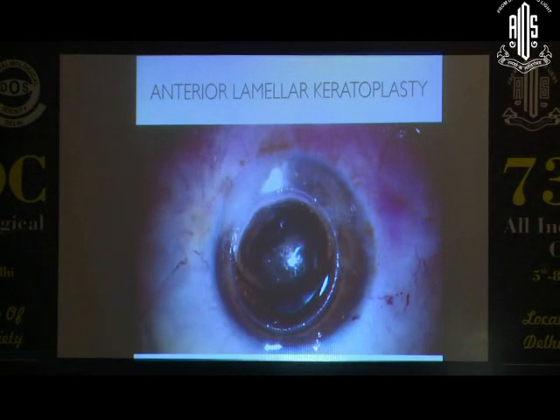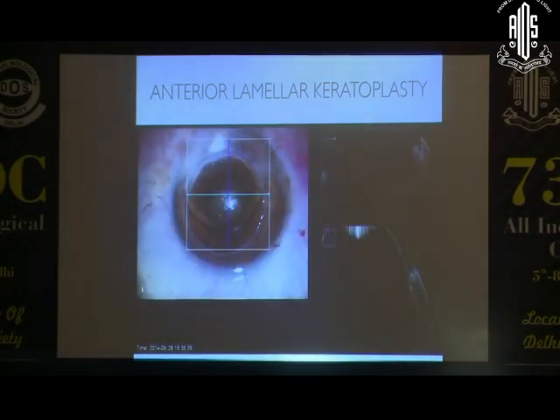And already it is looking very clear. So now you're ready to put your graft back in place, but what do you do with the bubble? So we decided that instead of leaving the bubble in place, you can see the dimensions of the bubble actually look quite big. We thought we were going to remove the bubble from the gap that is present in this potential area. So again, how do you do that?